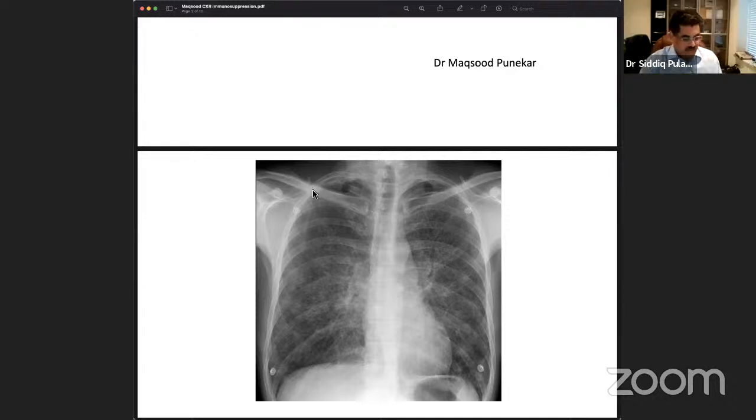Now, one more question. As a physician, when we ask for a lateral chest X-ray, the radiologists get a bit irritated, because they think most things can be seen on the PA view. But as clinicians, we are always unsure, because the patient may have a history where we don't feel fully comfortable. So could you list situations where the lateral view is useful?